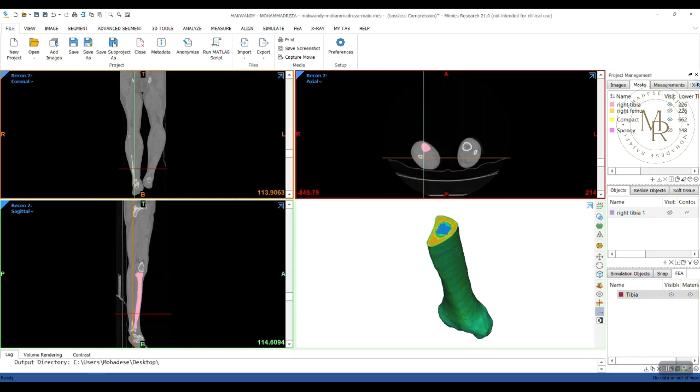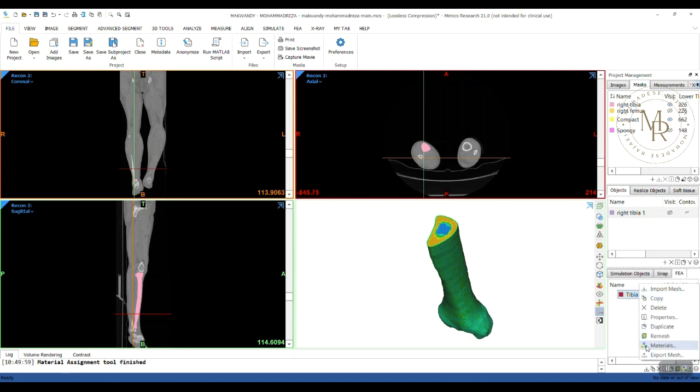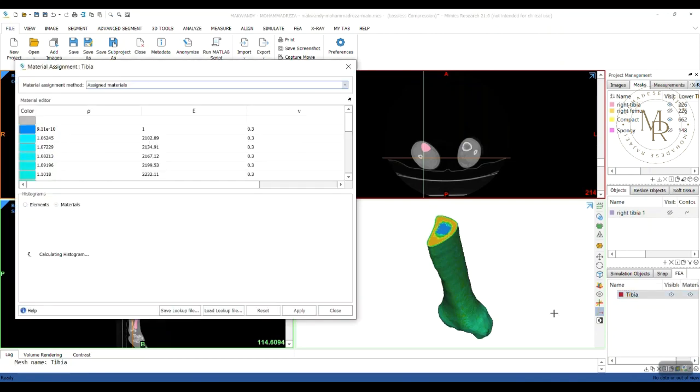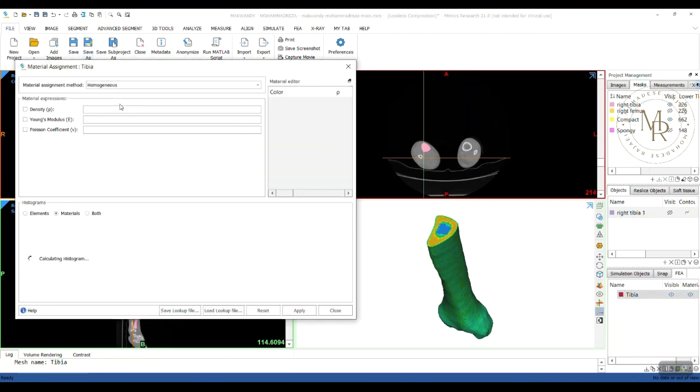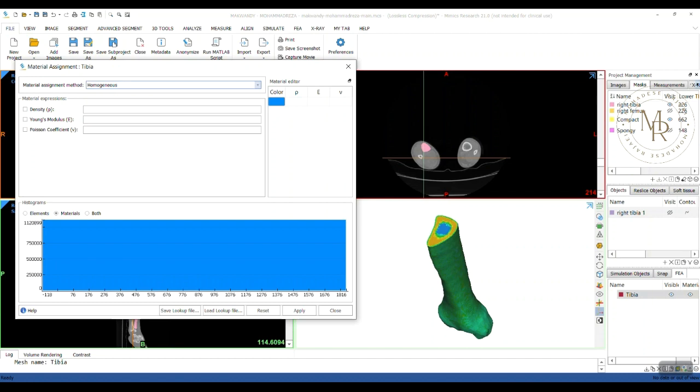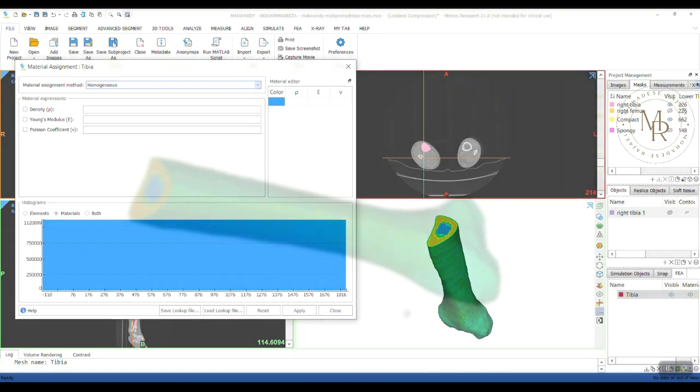Also, you may use offset method for separating cortical and cancellous bone layers from each other. And then, limit your material assignment to compact or spongy masks. Also, from here, you can see that you can use another method, like here, homogenous. For example, when you have a plate for a fracture or something, and it has the same value for each mechanical property.